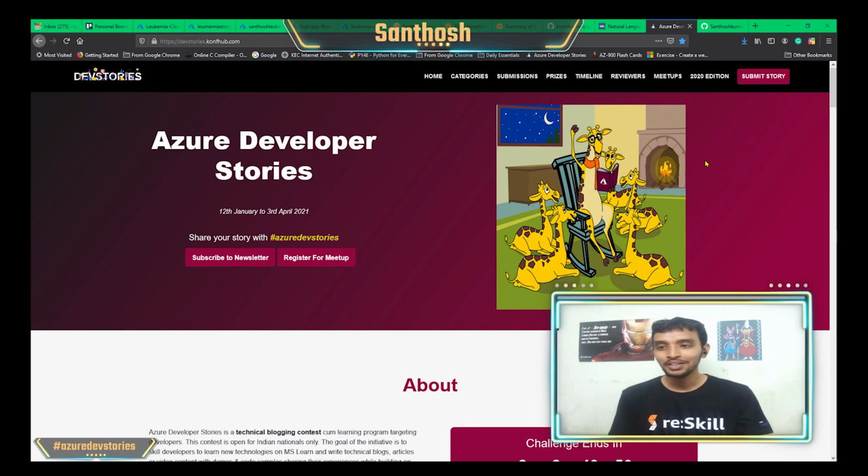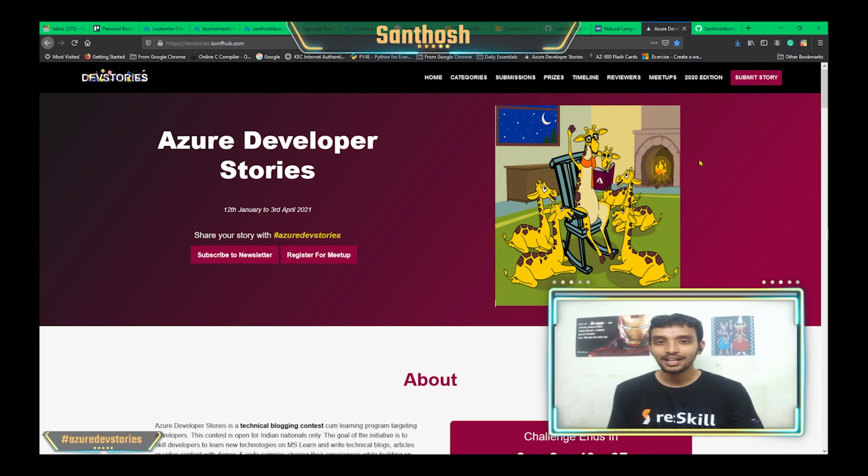Welcome to another video. In this video, I'll walk you through a live demo of Leukemia Classifier that is deployed on Azure Cloud. I was working on this for a couple of weeks now. 5 to 6 days of my work time it took to complete this entire thing. I'll just walk you through the various aspects of it. I tried it out when Dev Stories came up.